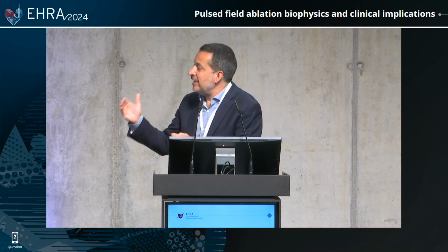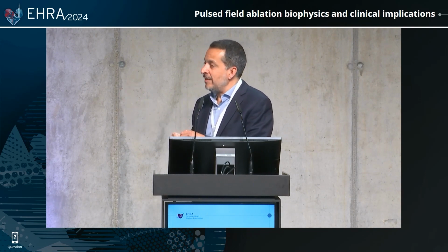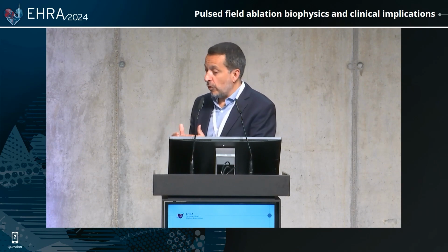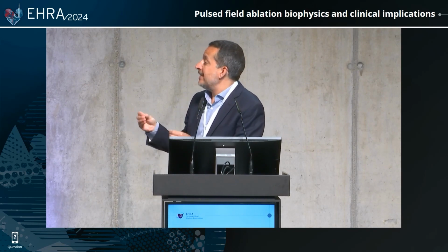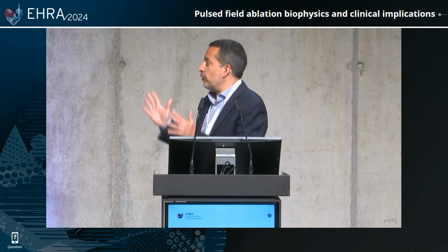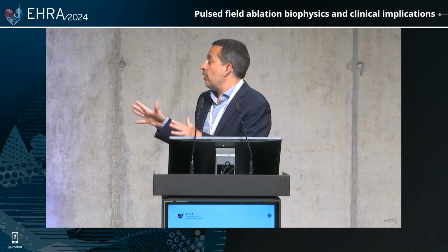So we need to know more about the behavior on MRI and to understand the process. We still don't know many things about that lesion formation. We know that those cells get destroyed, but the fibrosis that gets involved in that tissue that has not been denatured, a tissue that keeps its architecture, is going to be totally different.